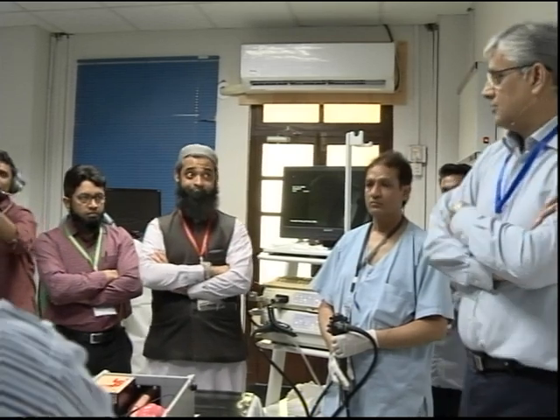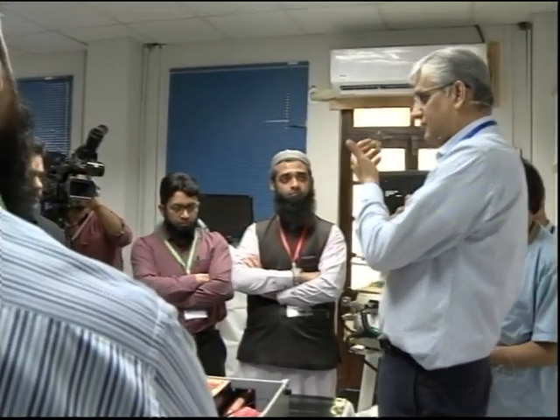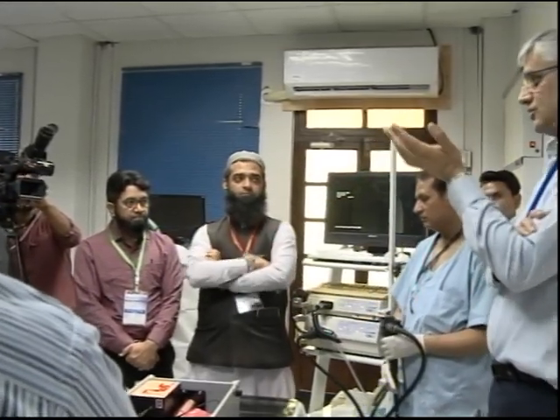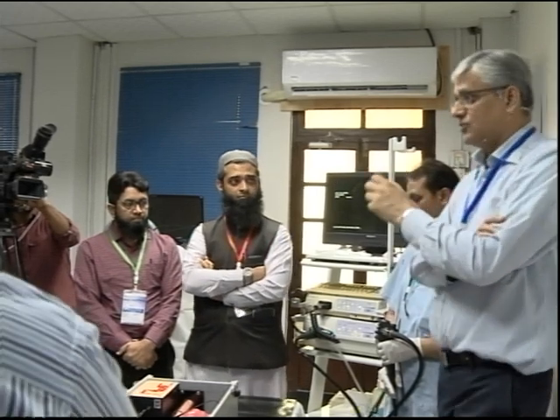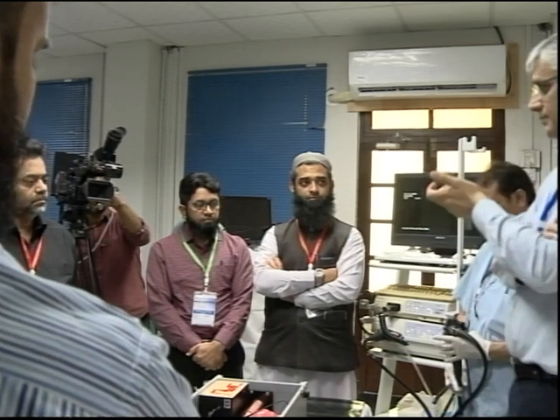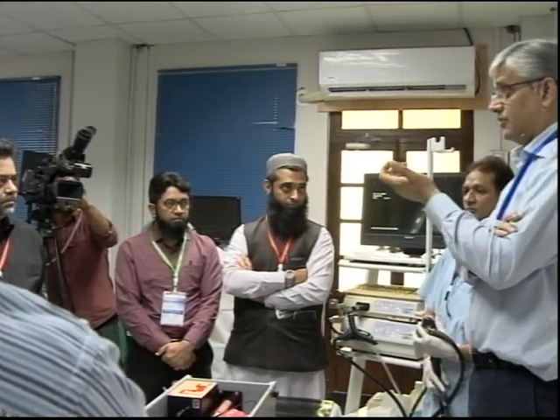Okay. So position, done. Now you have the scope. We check systems like we've gone through in the course. It's important that your elevator is working, your right-left, and your big wheel up and down are working. Right-left utilization is very limited, but sometimes when you're actually trying to cannulate, it helps. And we'll discuss that as we go into cannulation.